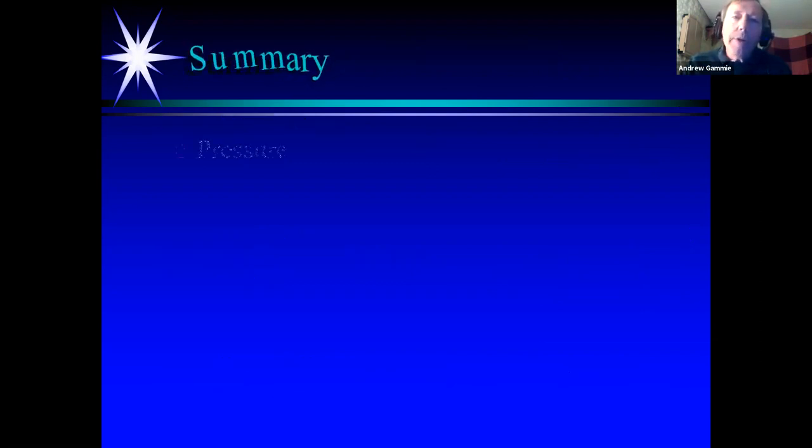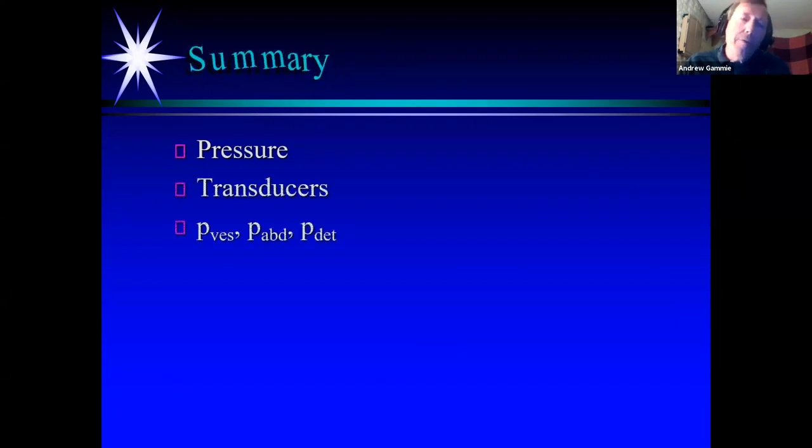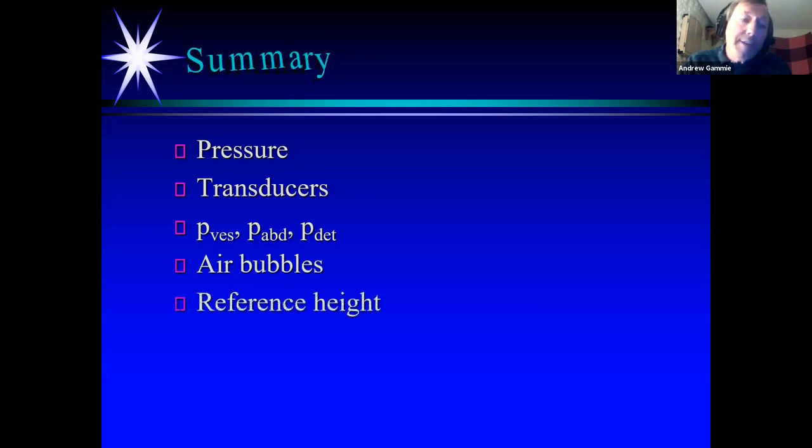So in summary, this very brief tour through physics has given you an idea, I hope, of pressures and transducers and what we're measuring. You've got the idea that air bubbles are wrong and that reference height is right and that zero is a necessity.